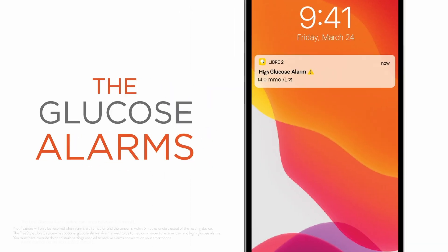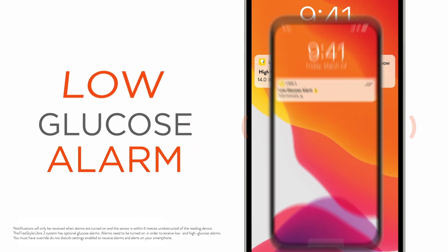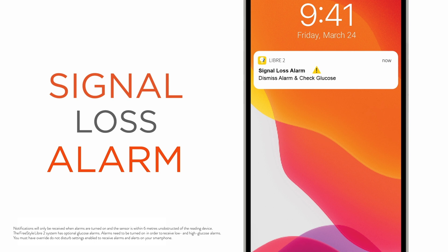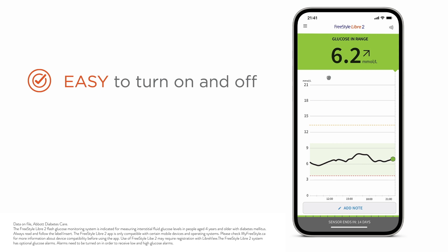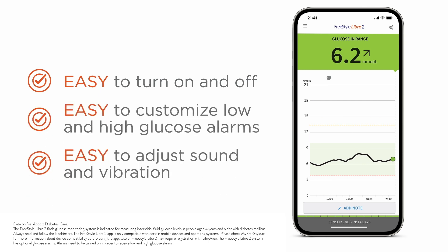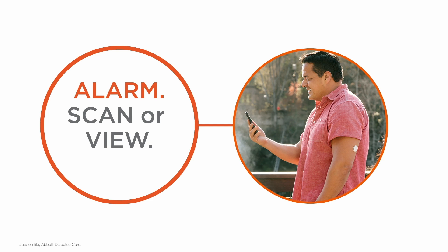The Freestyle Libre 2 system has optional real-time glucose alarms that can let you know the minute your glucose is too high or too low, so you can take action. The signal loss alarm occurs when the sensor loses its signal to the app or reader. You can easily turn the glucose alarms on and off, customize your high and low glucose alarms, and adjust the sound and vibration. After you receive an alarm, simply scan or view to see your glucose reading and take appropriate action as needed.